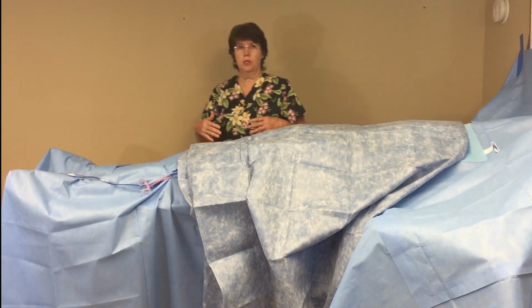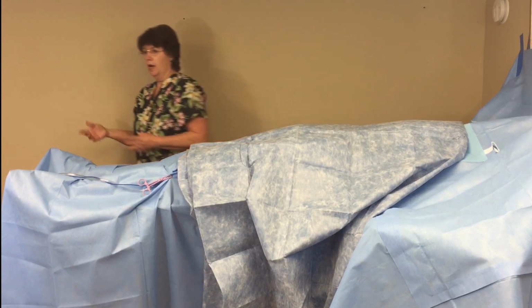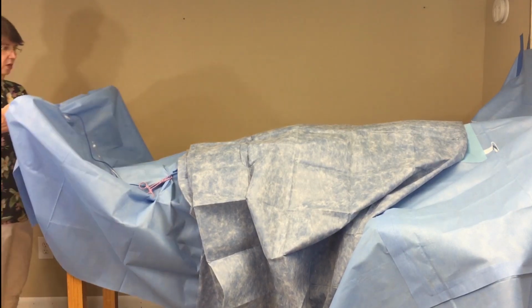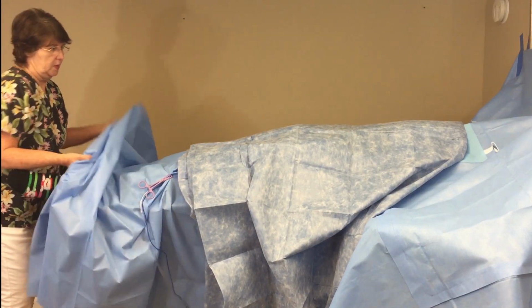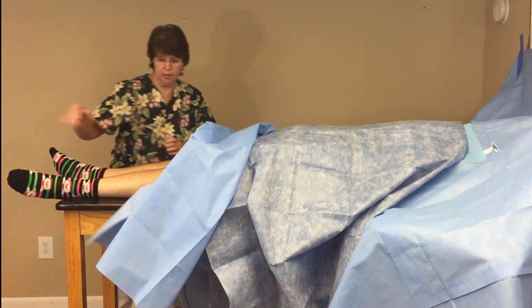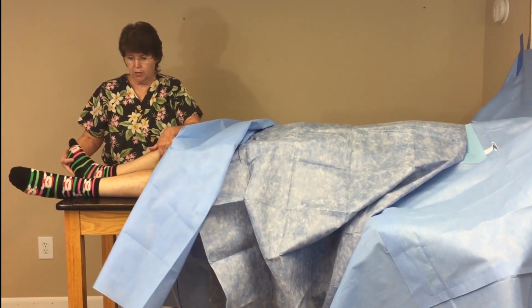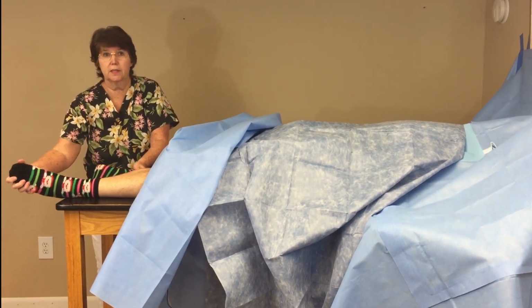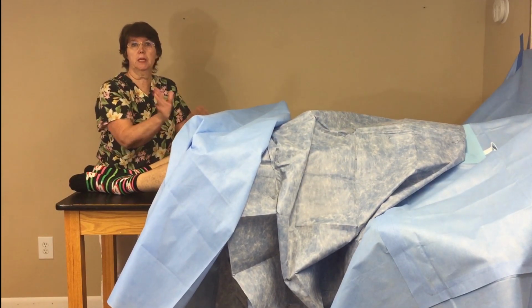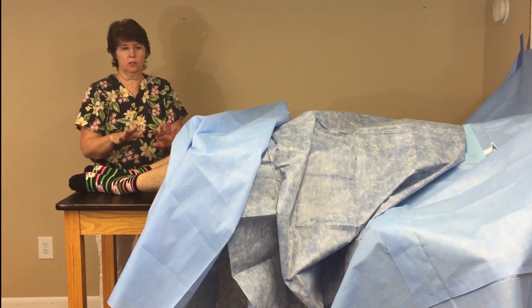Now I'm going to have to switch roles, and I'm going to have to be the circulator. Then the circulator comes in and takes this unsterile part and rolls it up over the sheet that you've done. They frog leg the patient, who has some marvelous little Santa stockings on here for some reason, and obviously they'd have to push this up a little bit more, but for demonstration's sake this is good enough.